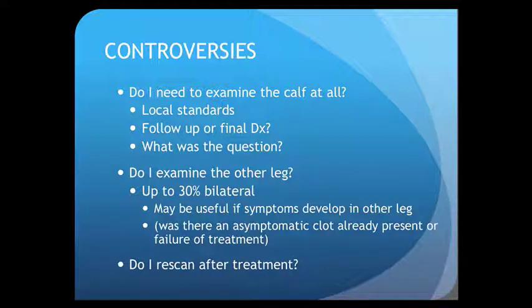Finally, as I've mentioned earlier, it is often useful if a patient represents later to have had a scan that has been performed at the end of treatment, so that you know what the new baseline was. And therefore, some places will do this, some places will not. And once again, I think you need to know what your local policies are and follow those.